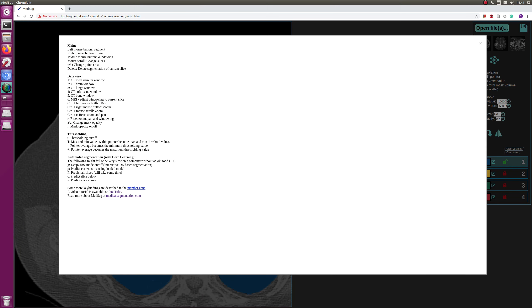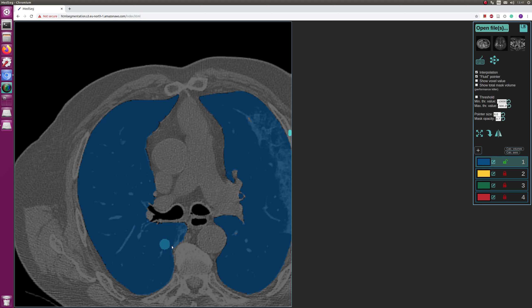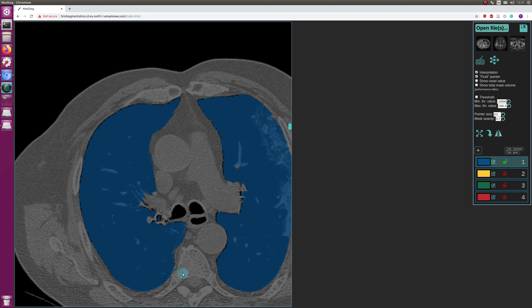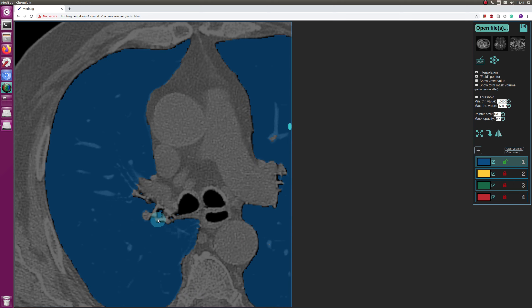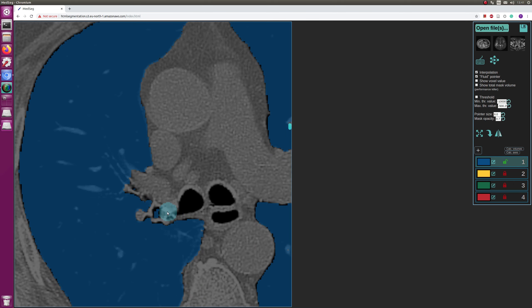And all the keys, almost all of them, are documented here, all the key bindings. Anyway, let's get back to the segmentation.